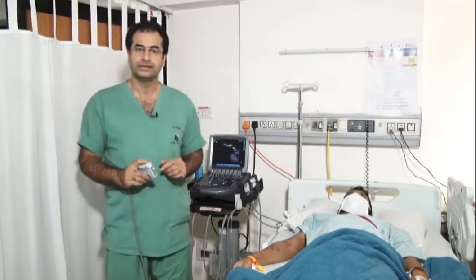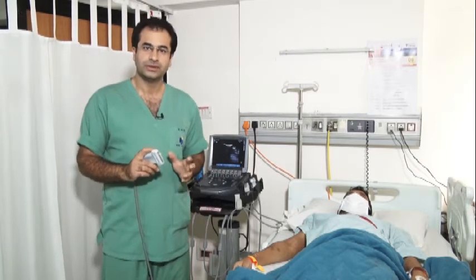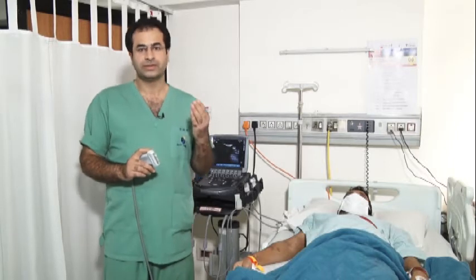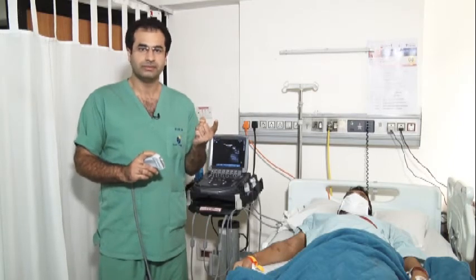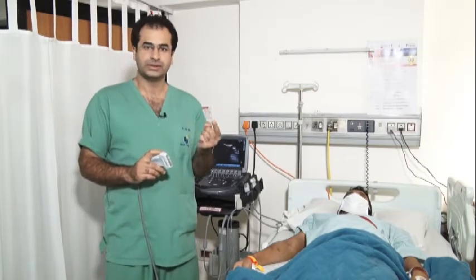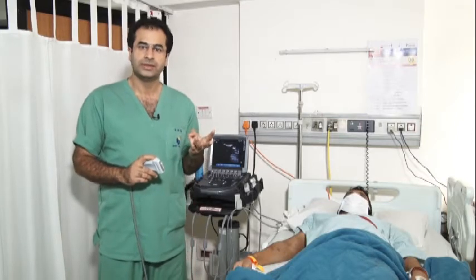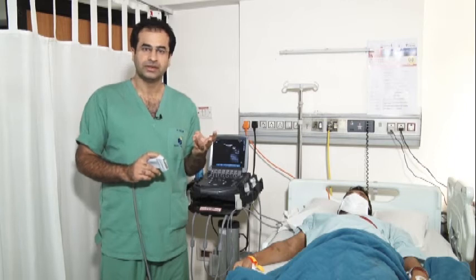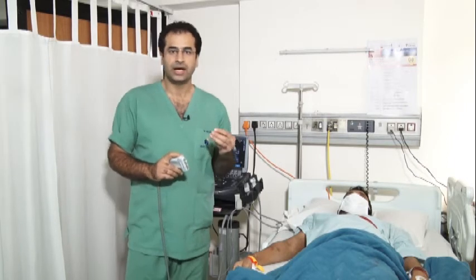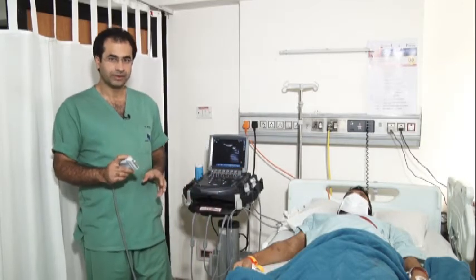Hi everyone. Next session is the Doppler of the AV fistula. We'll take 3-4 things in our mind. One, we'll see the feeding artery, radial or the brachial. Then we'll see the fistula anastomosis. Third thing will be the juxta anastomotic segment, meaning the first 3-4 centimeters, and then the body of the AVF and the outflow of the fistula. So we'll start with the probe.